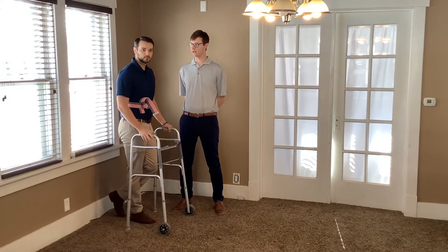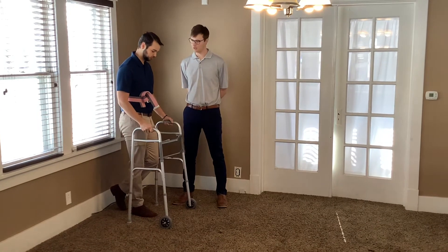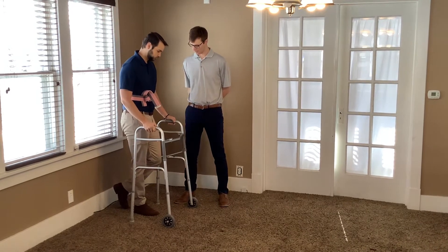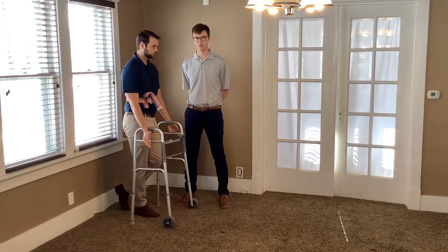I'll be instructing my patient on how to do three-point gait with a walker. Before we start ambulating, we're going to make sure that the walker fits properly like we discussed earlier. We need the hand rest to hit about the ulnar styloid process when his arms are relaxed.